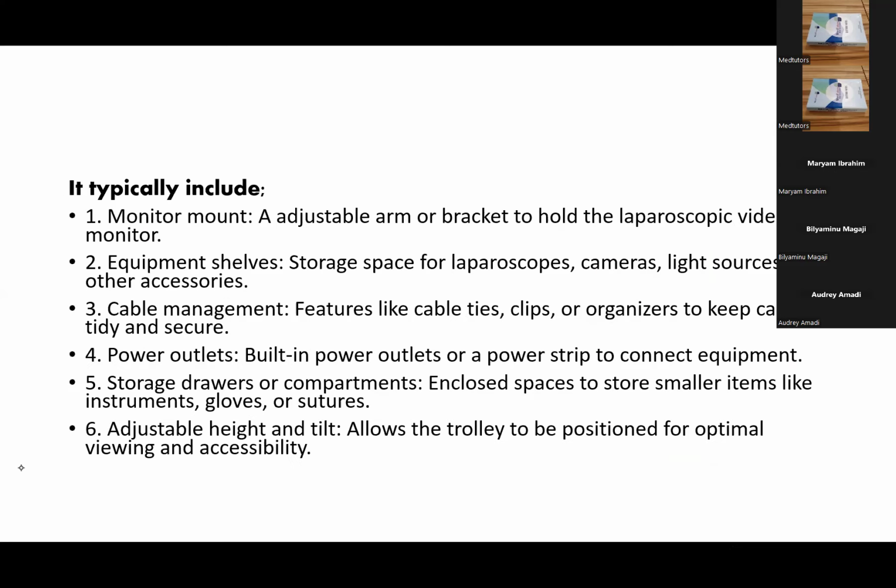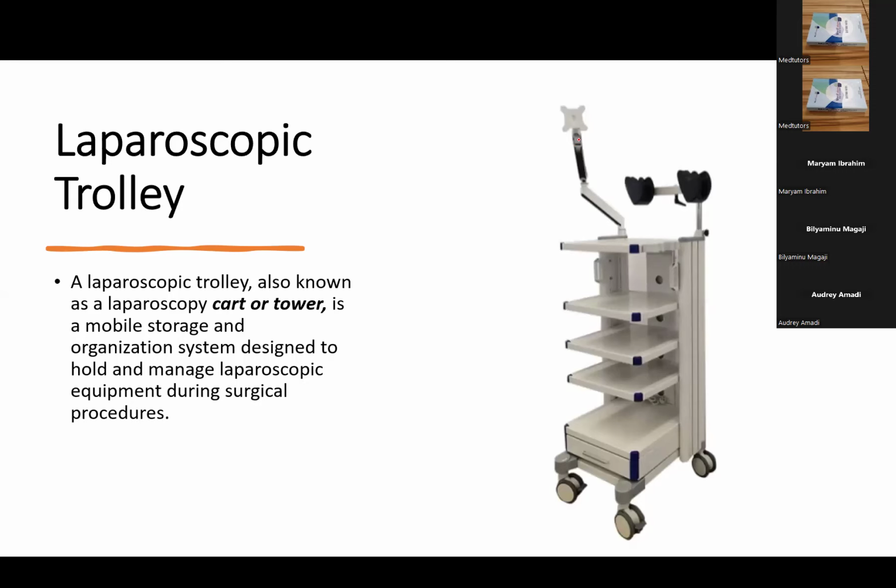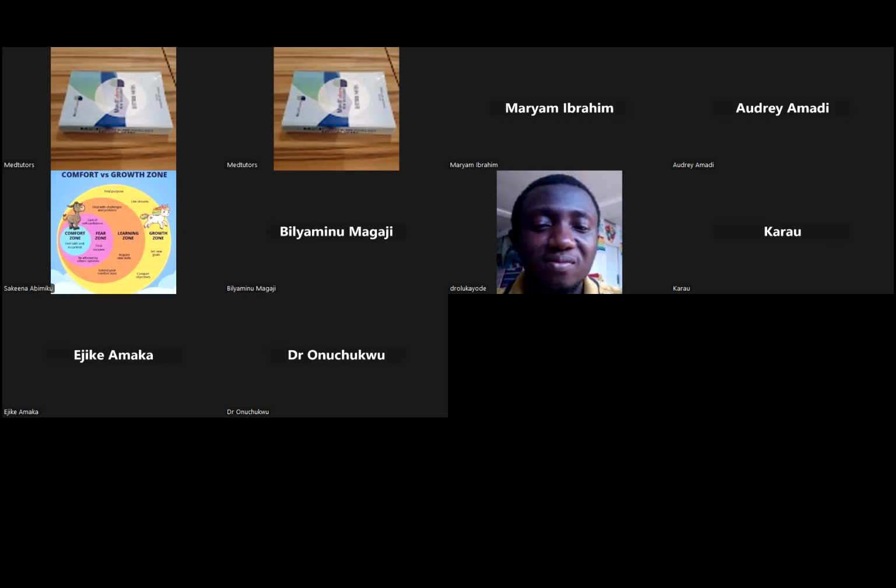Now, the trolley typically includes a monitor mount, where the monitor will be mounted. On this monitor mount, the video monitor is placed.